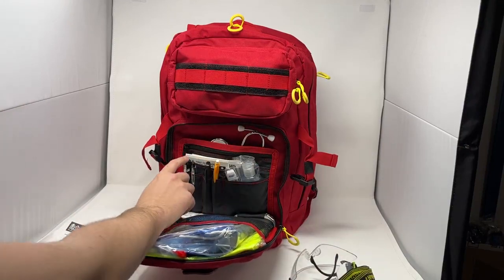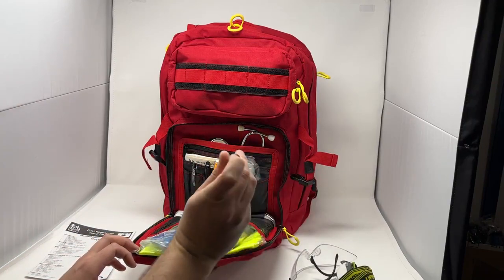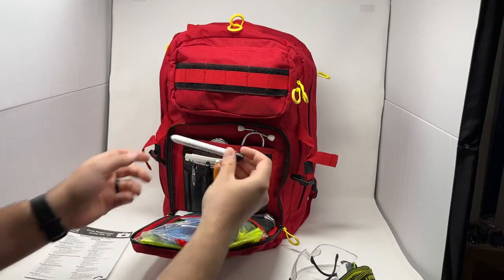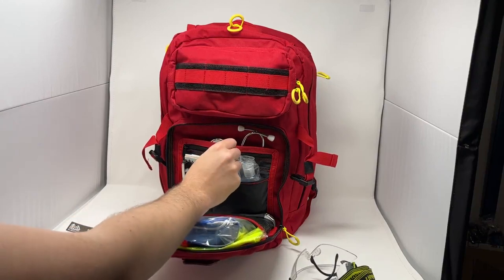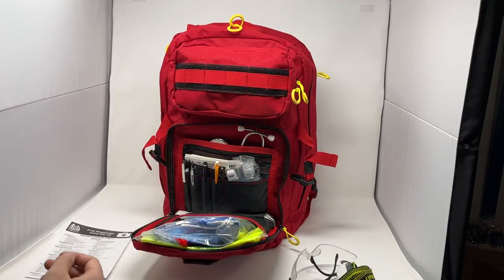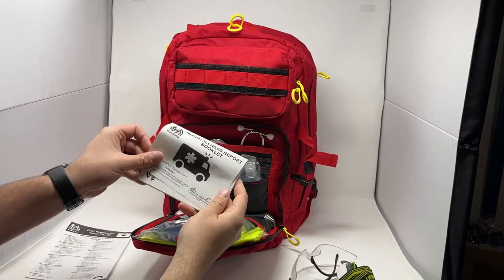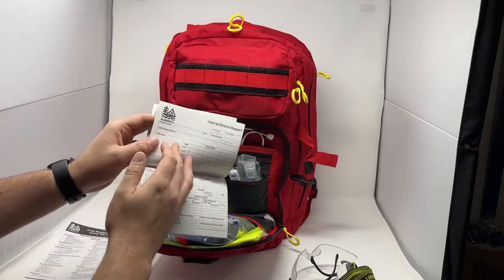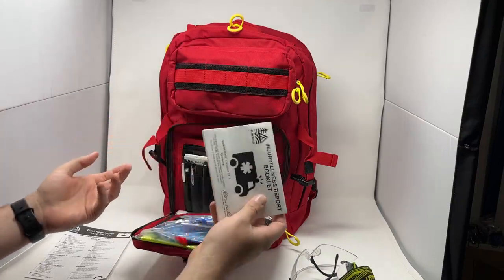For our stationary gear, we have a reusable pen light, which means you can change the batteries on this — it's a big upgrade from our last one. It's got your pupil gauge on there. We have a pen, a permanent black marker, and a pencil, just so you can write in all conditions. Back here we have our injury illness report booklet on write-in-the-rain paper. It has patient assessment reminders and a whole bunch of injury illness report forms to fill out and hand off to EMS.